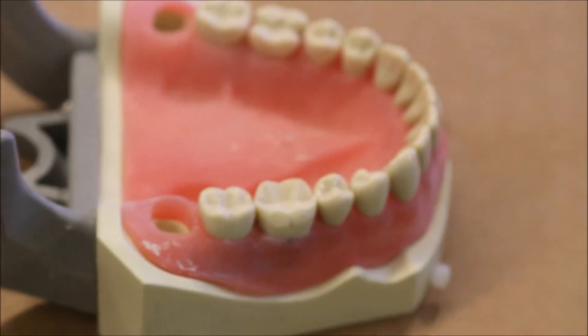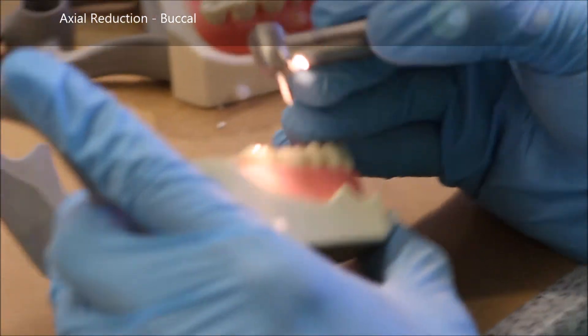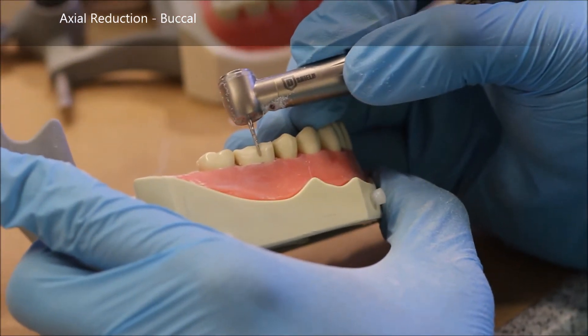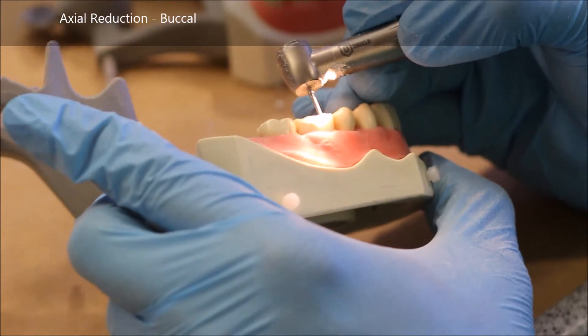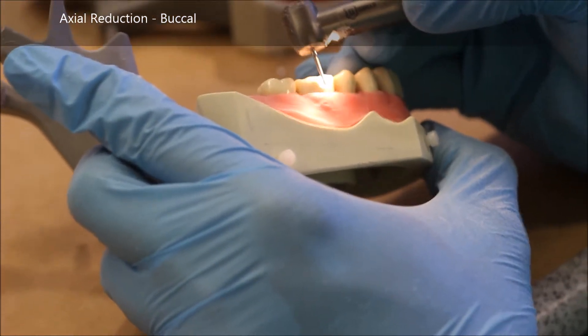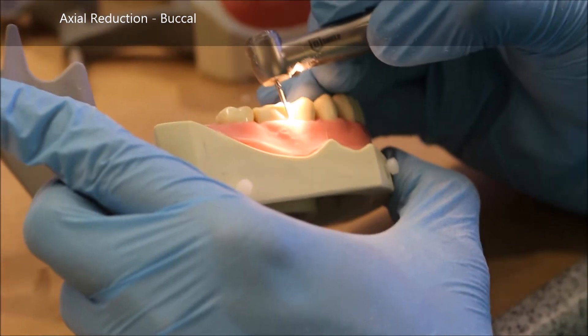Okay, so now we're going to begin axial reduction with the 878 burr. You see me doing a little practice swing there, trying to get my motion. What I'm doing now is taking the burr to the adjacent teeth to ensure that I have it placed at the right angle in order to get draw.